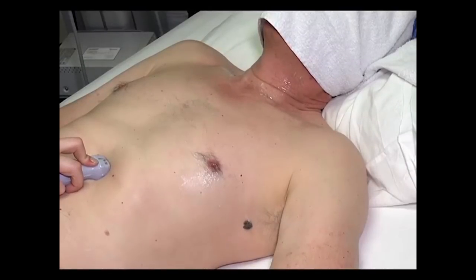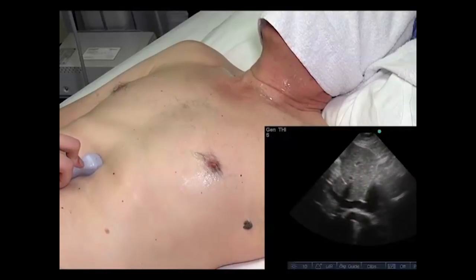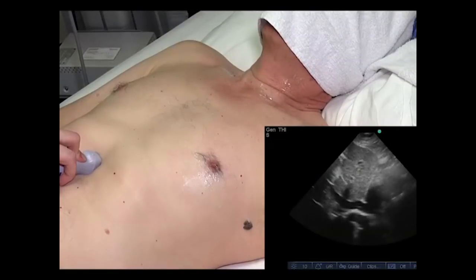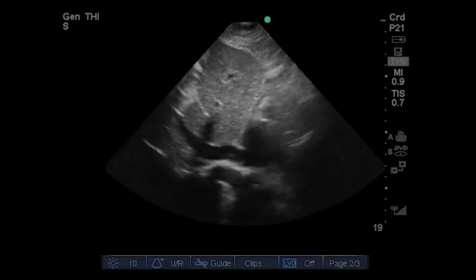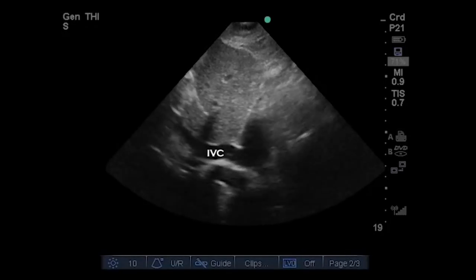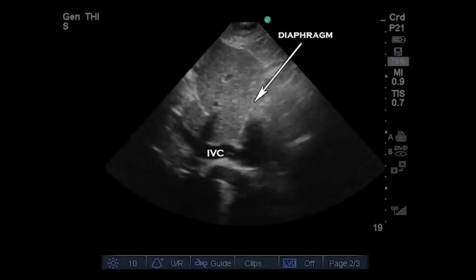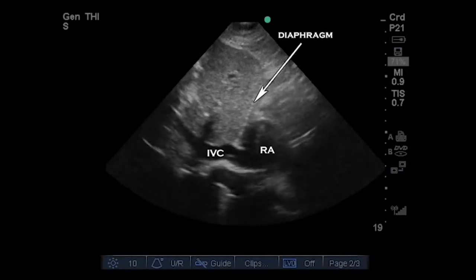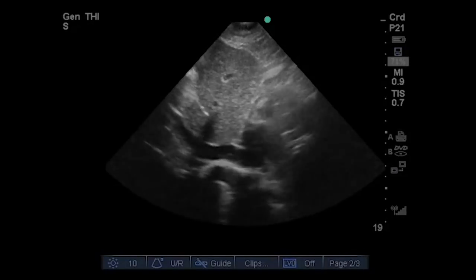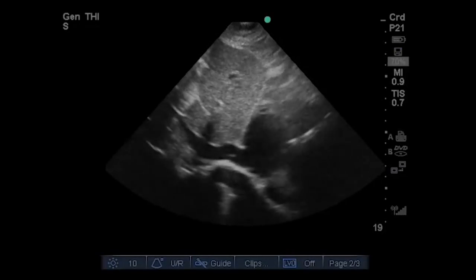The fifth and last mandatory view of goal-directed echocardiography is to examine the inferior vena cava. To obtain this view, the probe is rotated approximately 90 degrees counterclockwise and then tilted and angled to obtain a longitudinal view of the inferior vena cava. The examiner attempts to image the IVC as it passes through the diaphragm. We see the IVC in longitudinal view, the diaphragm as an echogenic linear structure, and the IVC passing through the diaphragm into the right atrium. We also see part of the liver. The depth, axis, and gain are all well set. The primary reason to obtain this image is to attempt to identify preload sensitivity.